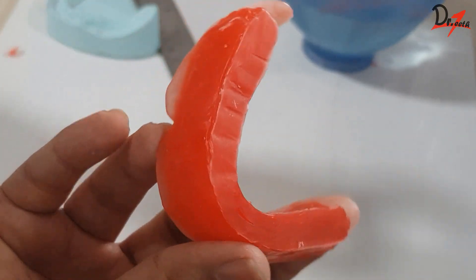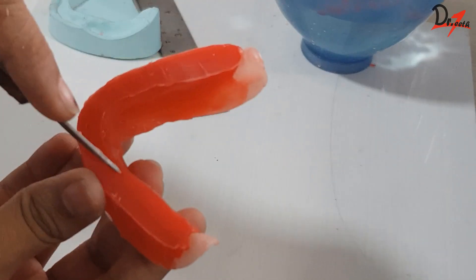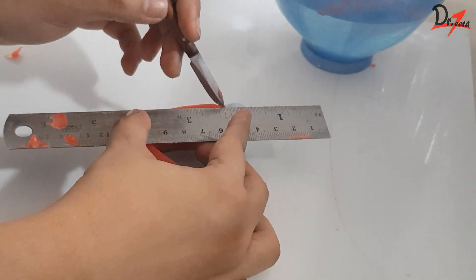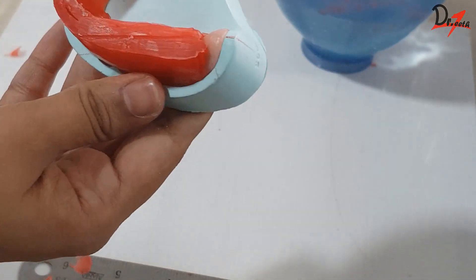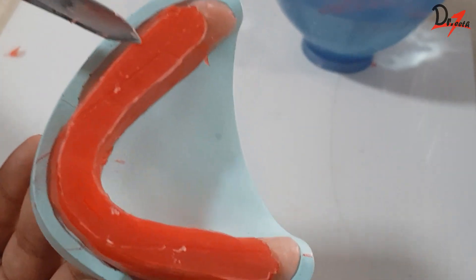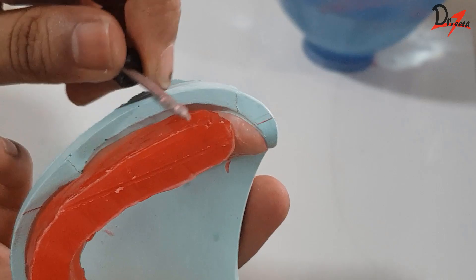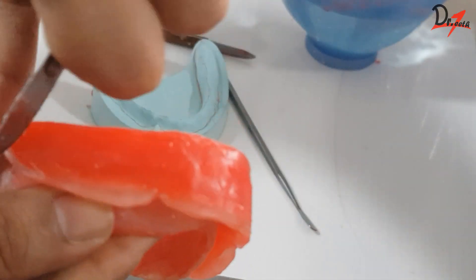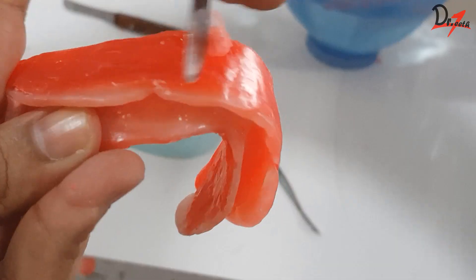To check whether our arch form is correct or not, we will take a metallic scale and transfer the line we had created on the mandibular cast — the line joining the posterior retromolar land area to the anterior canine region. We will extend it on the rim. Our rim has to be 50% towards the left of this line and 50% towards the right. Wherever there is a little more width on one side, you can use your instrument to reduce it or correct it. If there is less width somewhere, you can always add more wax and increase it. After we are done, we'll scrape off all the wax to get a smooth surface.